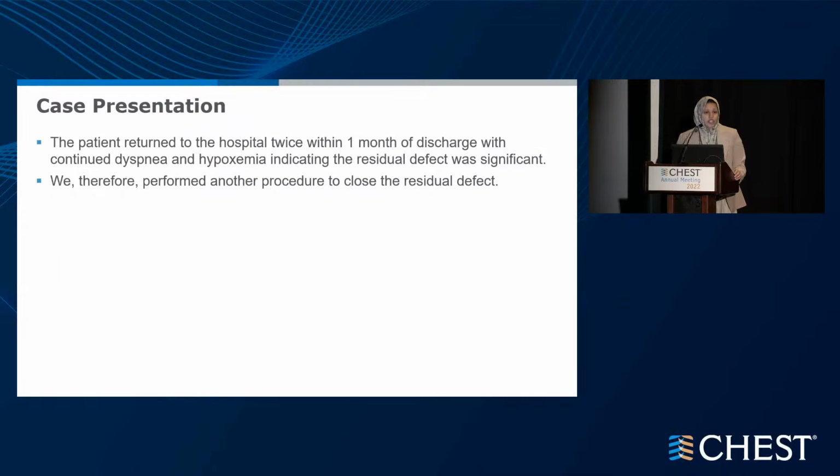However, the patient returned within a month, two times, with exertional shortness of breath, and that's why we decided to do another procedure to close that residual defect that she had.